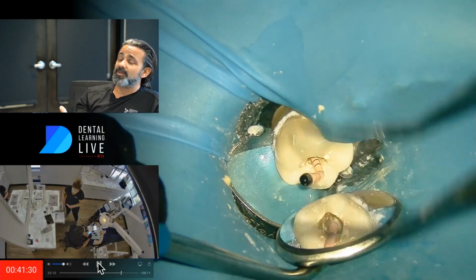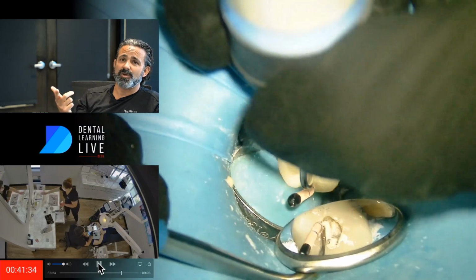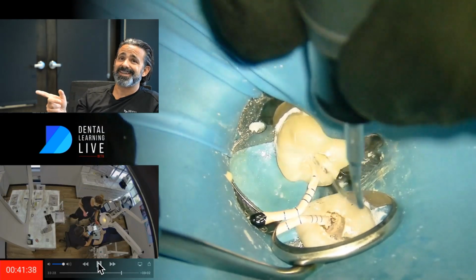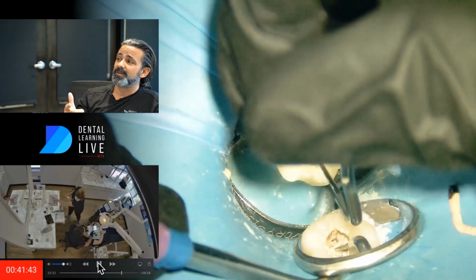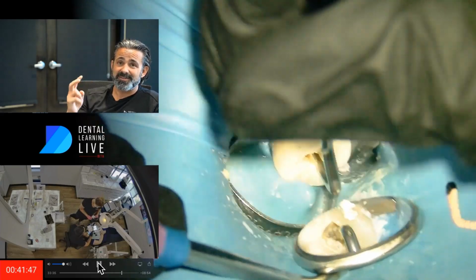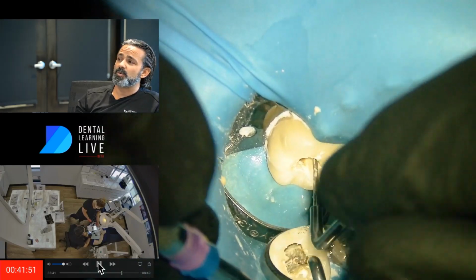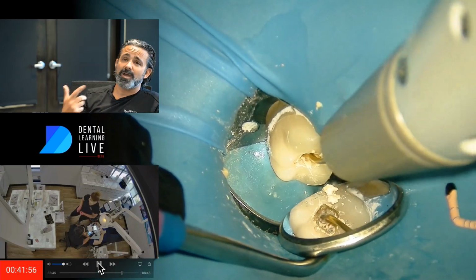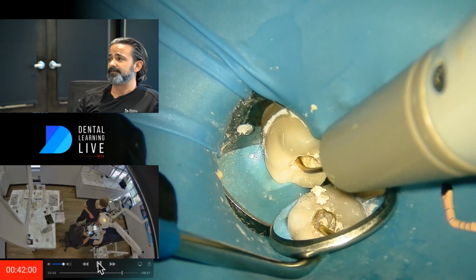What I did have going for me is these are calibrated cones, so I knew visually where my marks were on the cavo surface margin. What I just did is I said, well, I didn't really trim it that much. So I grabbed a 40, placed the 40 in, and it matched to my corrected length, if you will. I always pay attention to that. That's why I like calibrated cones. That allowed me to make those certain assumptions and go right back to keep my flow going and keep time down.